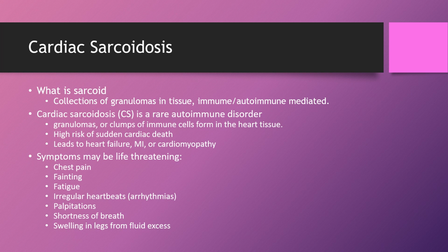It can be difficult to diagnose sarcoidosis as the clinical manifestations are often tachycardia or heart failure. But myocardial cells that are inflamed from sarcoidosis will metabolize glucose, and so that gives us an opportunity to diagnose it, where otherwise the best way to diagnose it would be through biopsy.